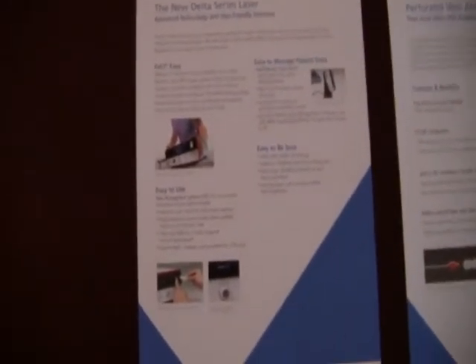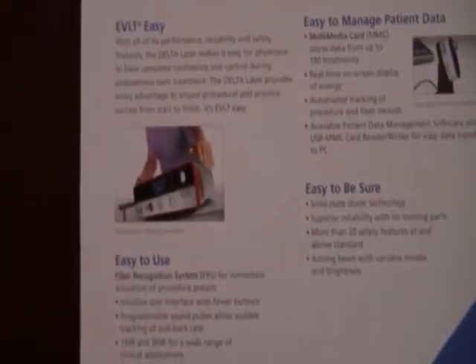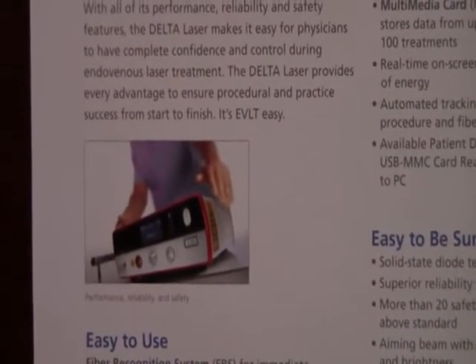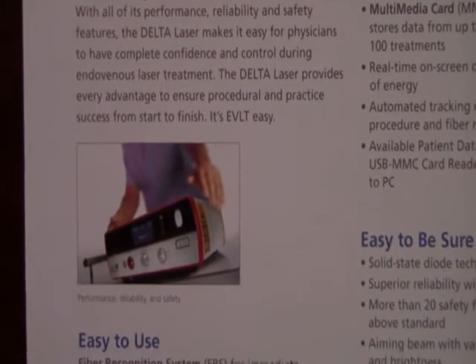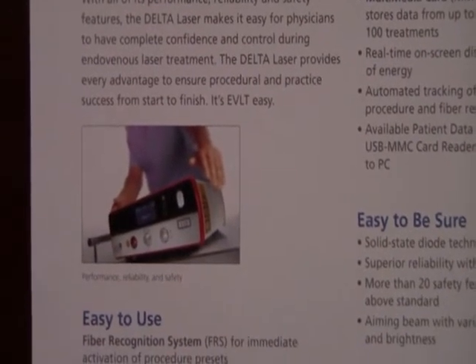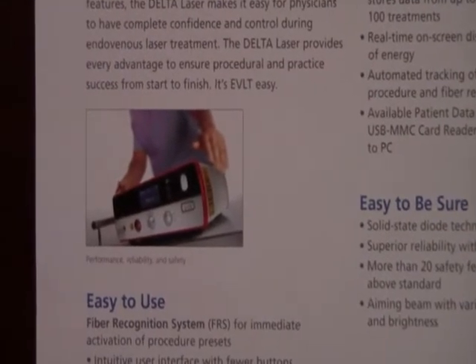Now, the first handout I will show you is about the laser generator. This provides the energy needed to rapidly heat the blood inside the vein, producing steam. The steam, along with direct heating of the vein wall, occludes and fibroses the vein.